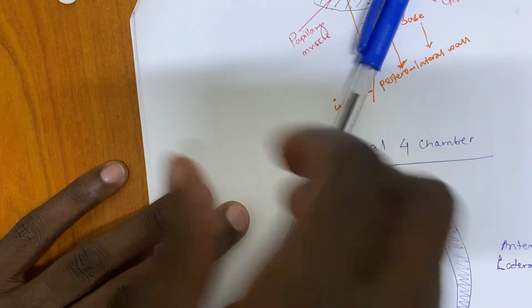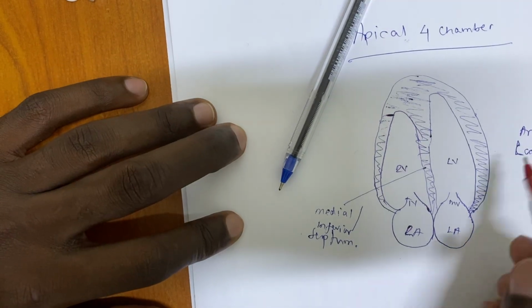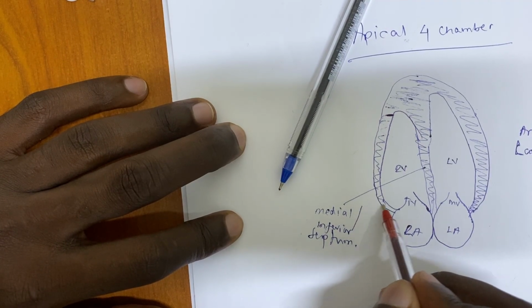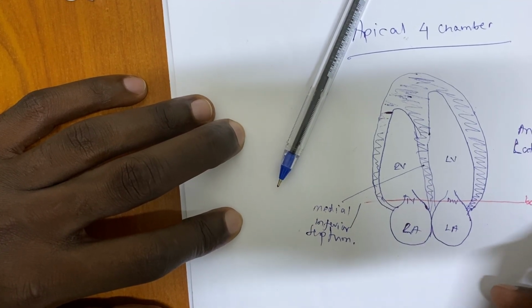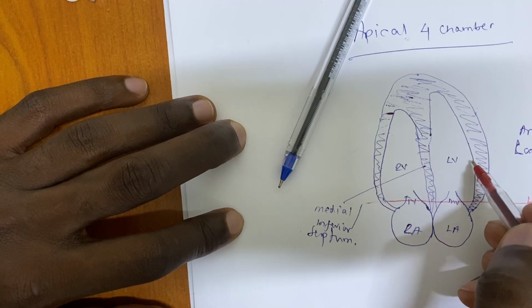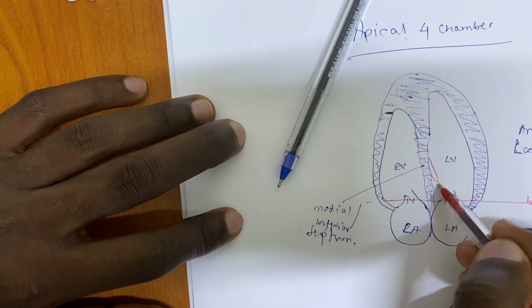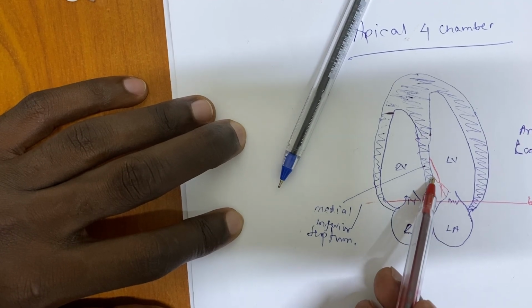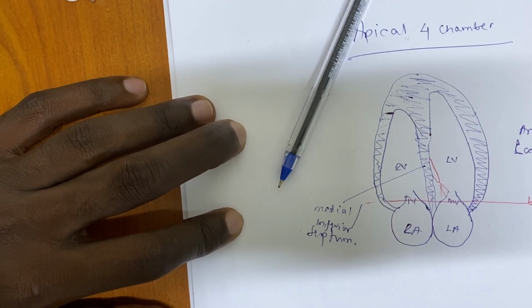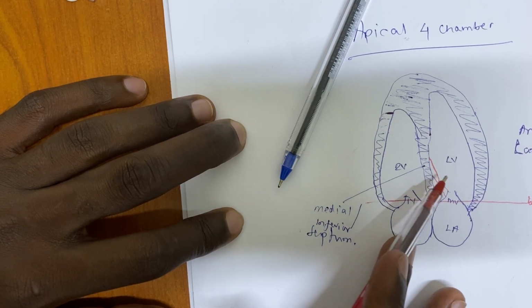Again we can go to base, mid and apex. So anterolateral, if you cut like this, that is base. If you cut like this, papillary muscles are here. Now we are going to see them, because this is the inferior septum, and we said the inferior or medial papillary muscle, the posteromedial papillary muscle, is on the medial side, on the septum.